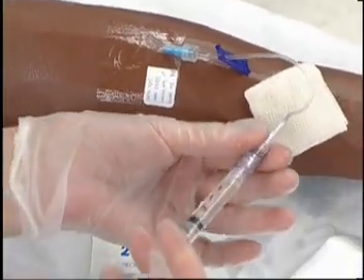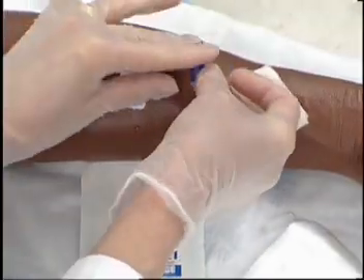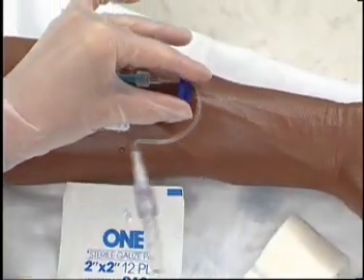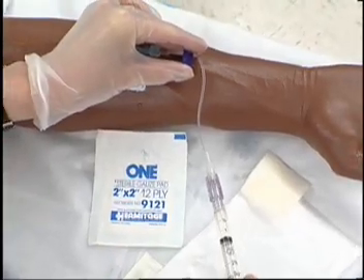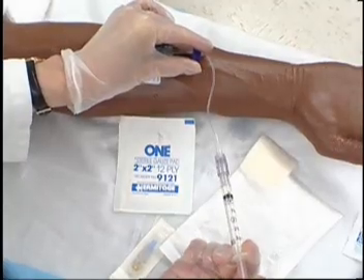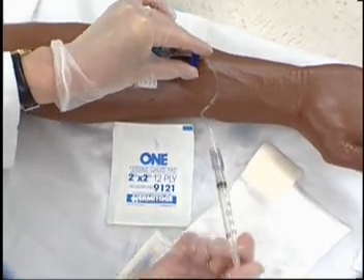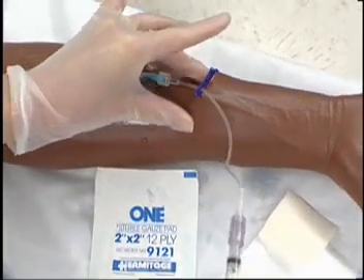Flush port with normal saline. Amount is determined by the size of the saline lock. Use positive pressure to prevent reflux of blood into the saline lock. If the lock has a clamp, maintain positive pressure by simultaneously closing the clamp while completing the flush.